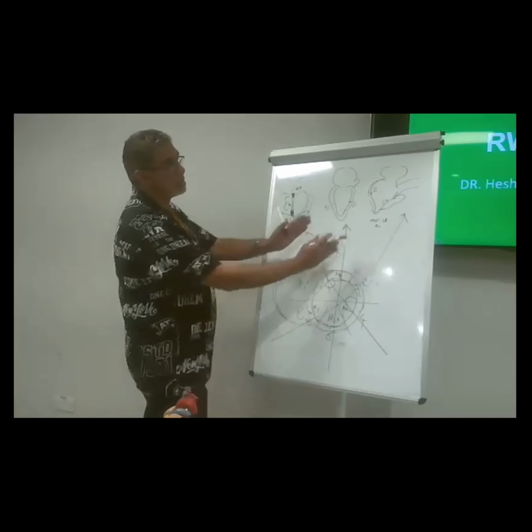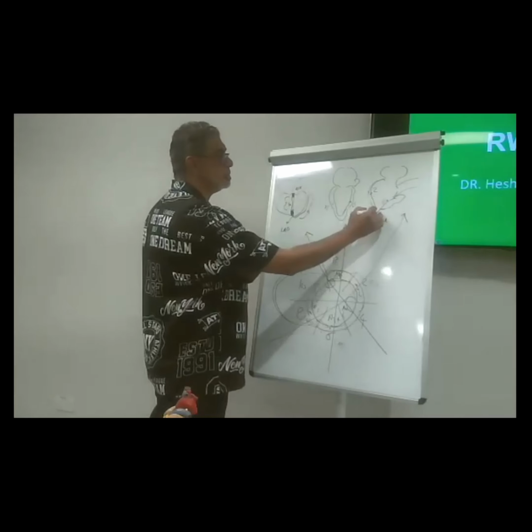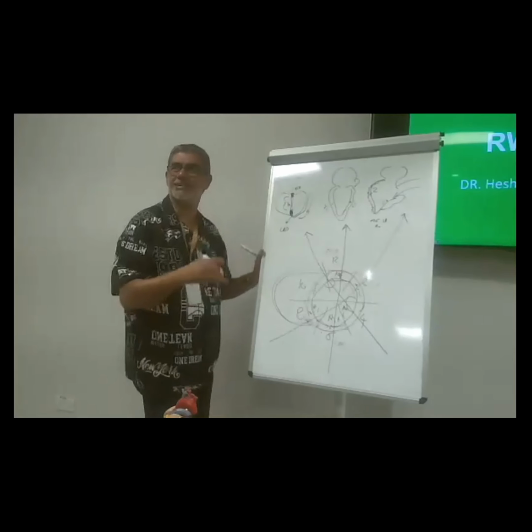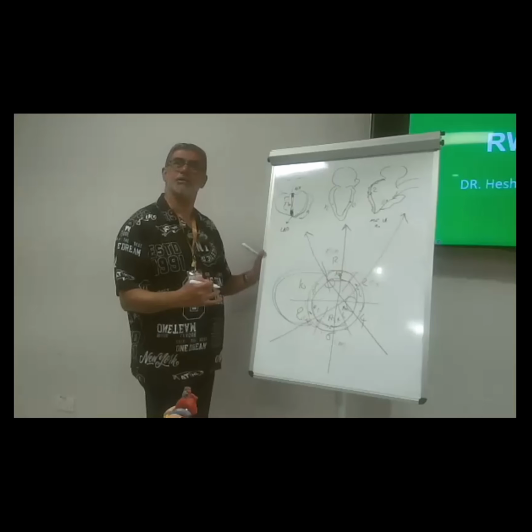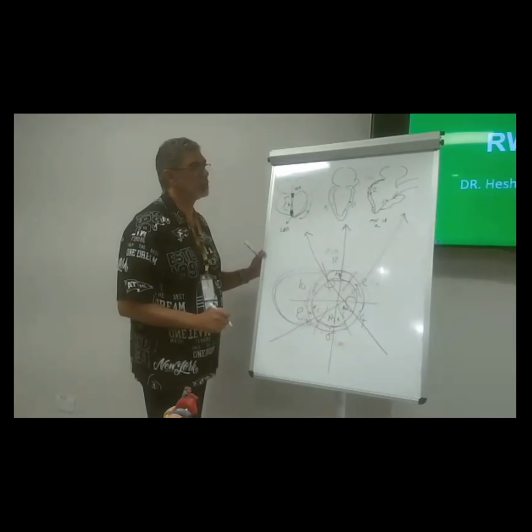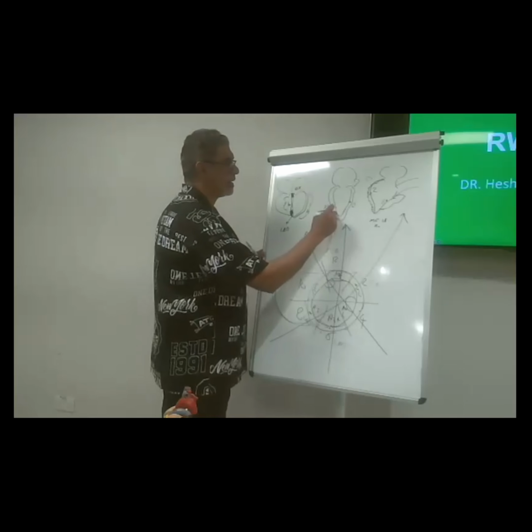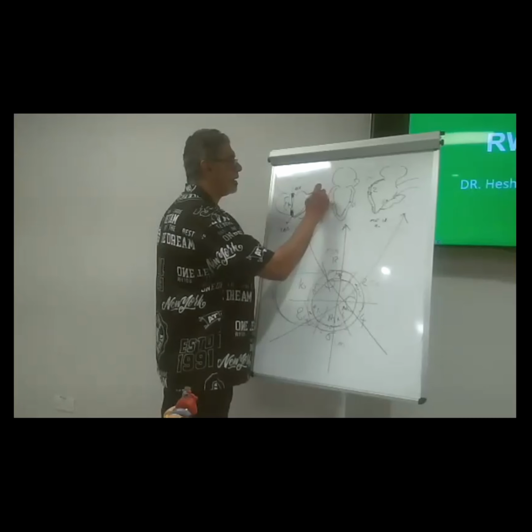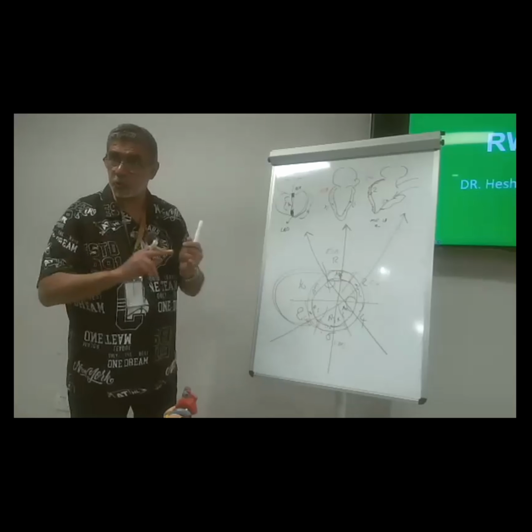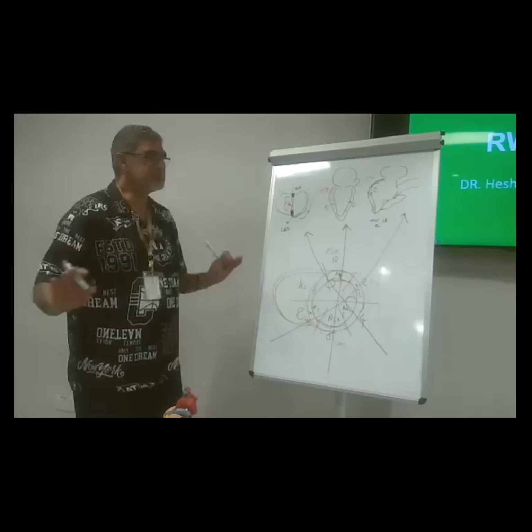Let's go here. 2 is circ. 12 is RCA, this is pure. No soda, no water. It's pure.